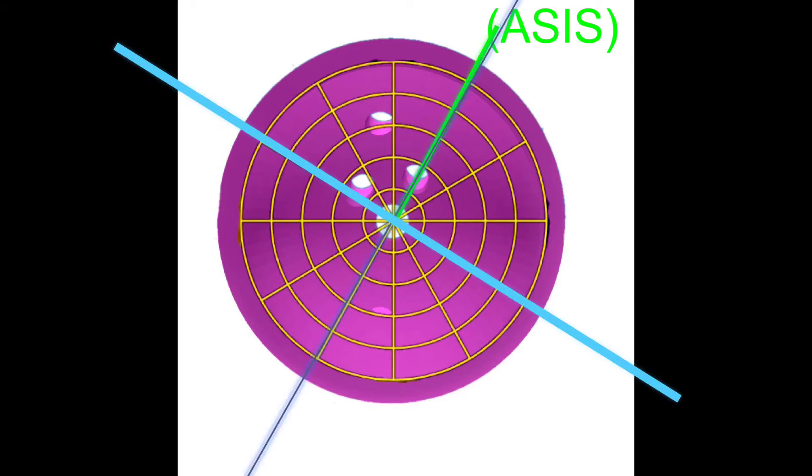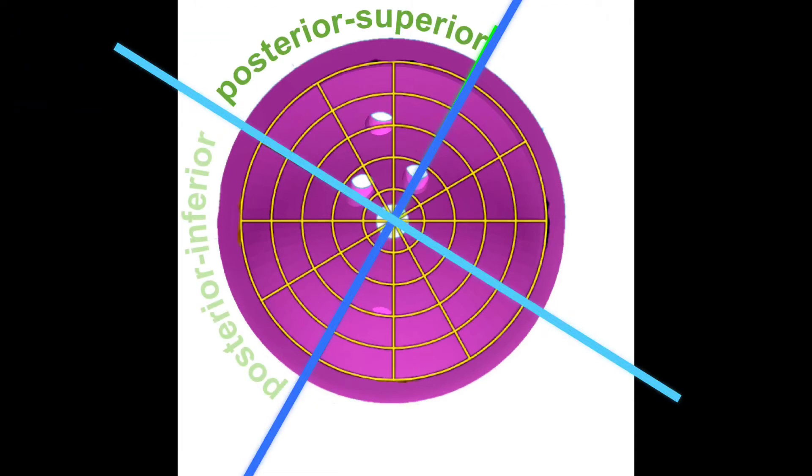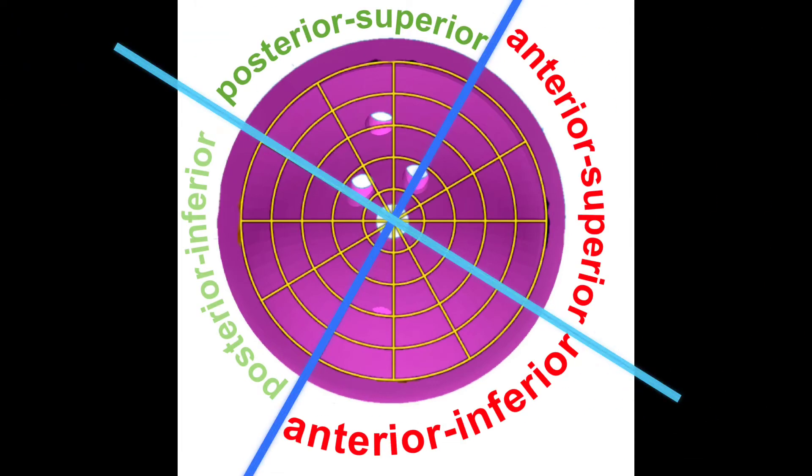Current quadrant zone tracks screw tip position in the acetabular quadrant system: posterior superior, posterior inferior, anterior inferior, and anterior superior quadrants.